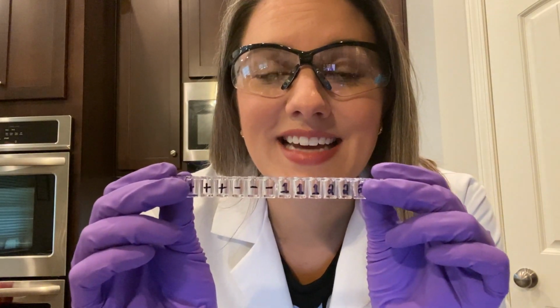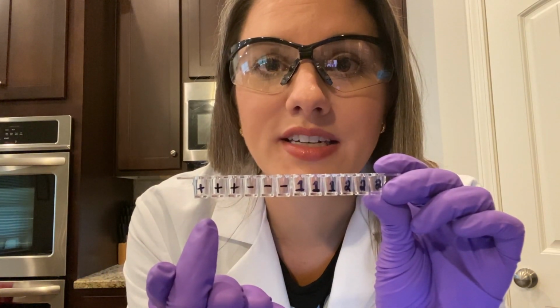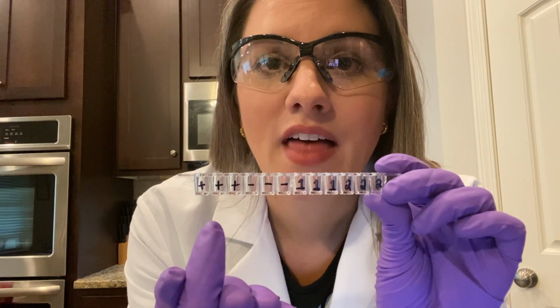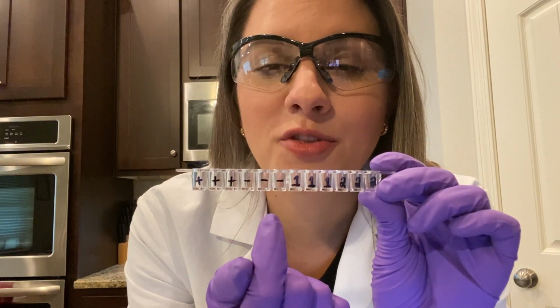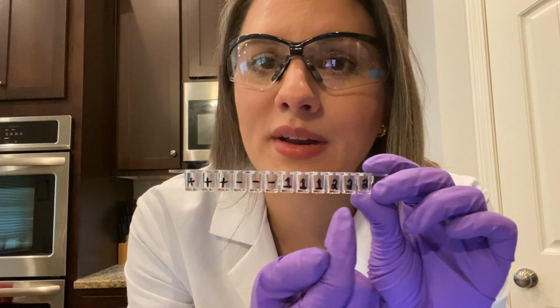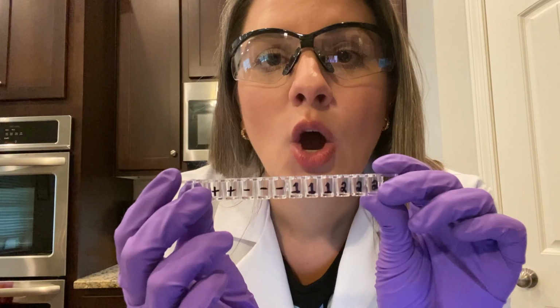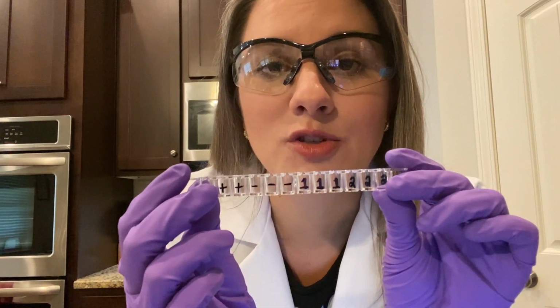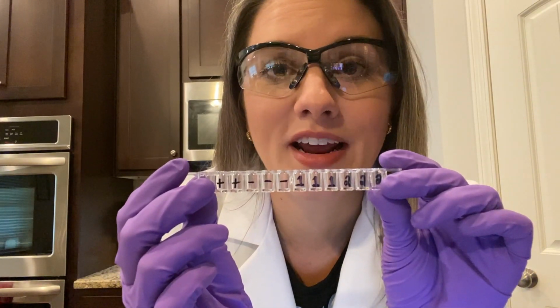So here's our testing container made of polystyrene plastic. The first 3 wells are labeled with a positive. These are our positive controls. The next 3 are labeled with a negative. These are our negative controls. Then we have 3 labeled with the number 1 and 3 labeled with the number 2. These represent samples from our 2 patients. We're running each sample 3 times so we can be confident that the final result is valid and also account for any human error. Let's do the test.